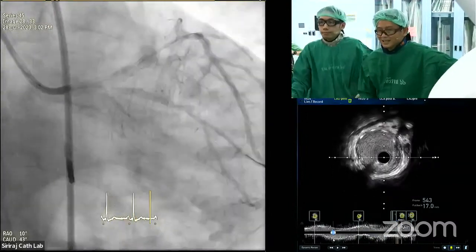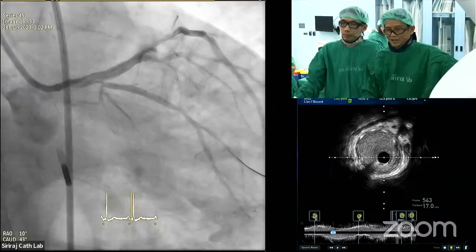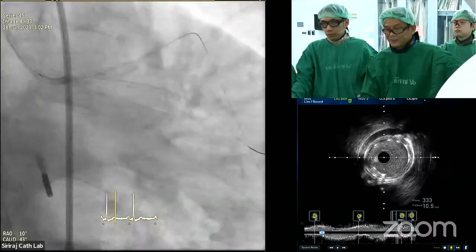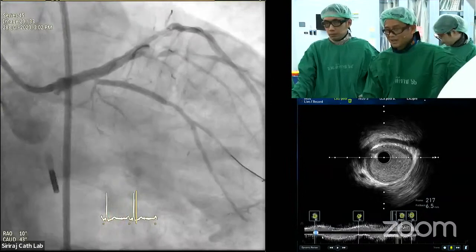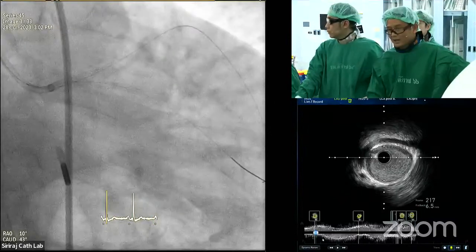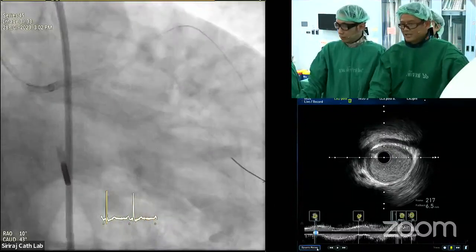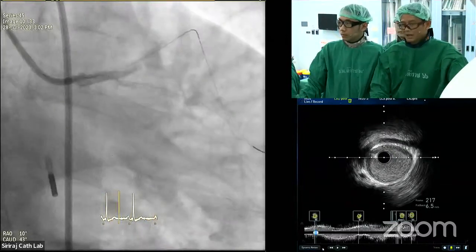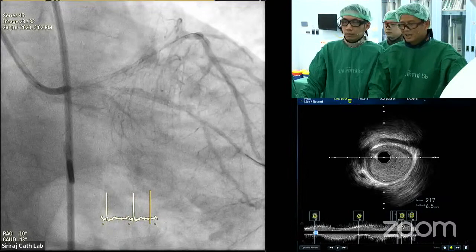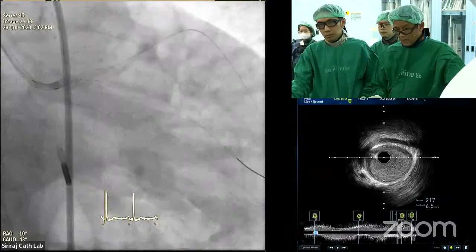Yeah, good, good. Okay, so I think last time, before you left, we were stenting from the left main to the LAD using a provisional stent strategy. There was some concern about the ostial circumflex, but initially the MLA on the ostial circumflex was 4.0. Because of the complexity of the case, the low EF, and the CTO of the RCA, I decided to just do provisional. Usually if I plan to do a two-stent technique, I will plan upfront. So I go by definition, two criteria.